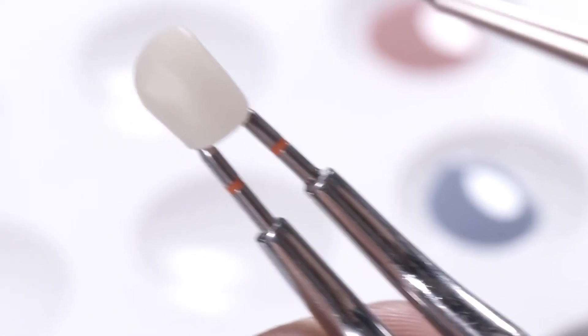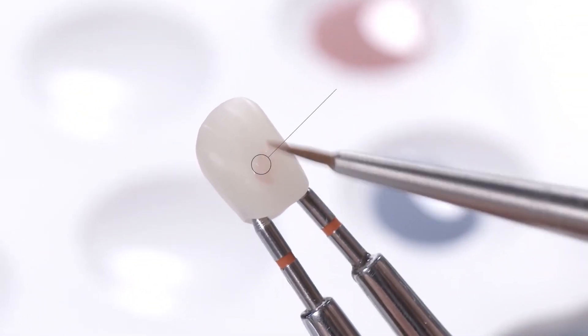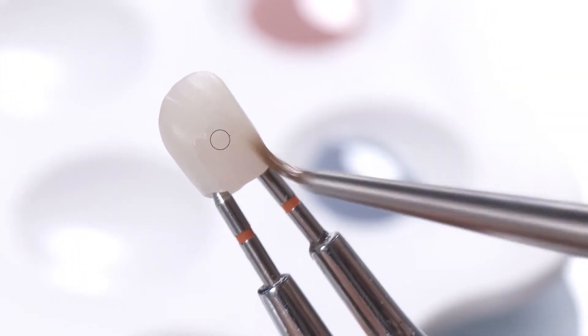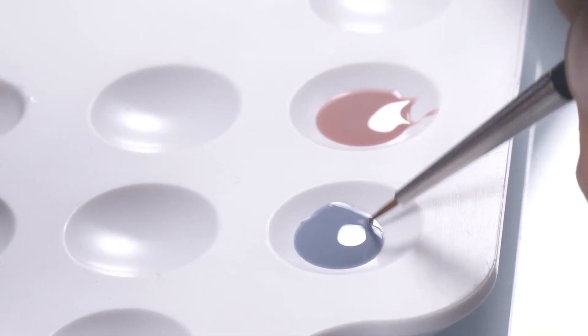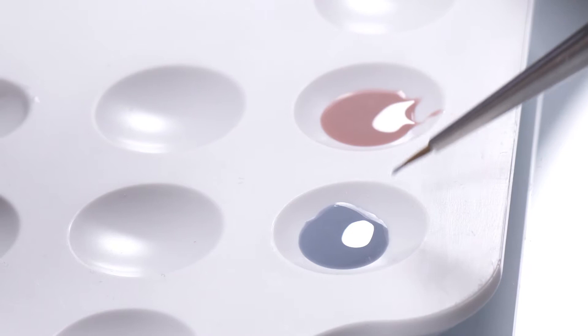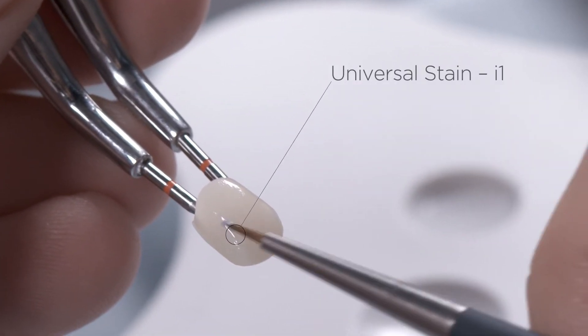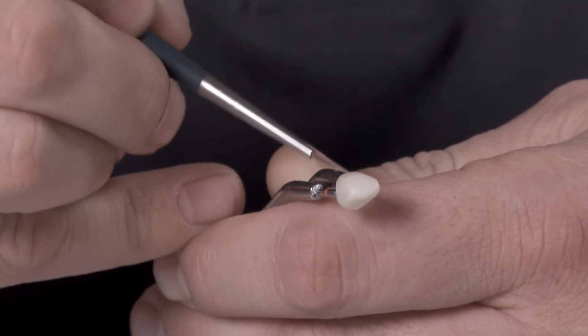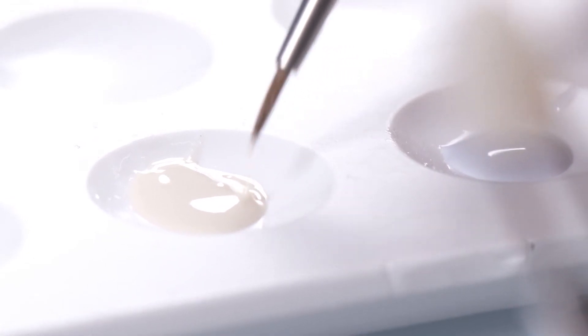Simply customize the crown body with a bit of pink. Emphasize the enamel ridges with incisal stain I1, and support the incisal area with its mamlon structures with some cream.